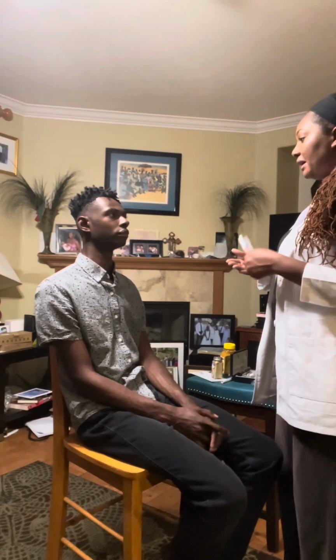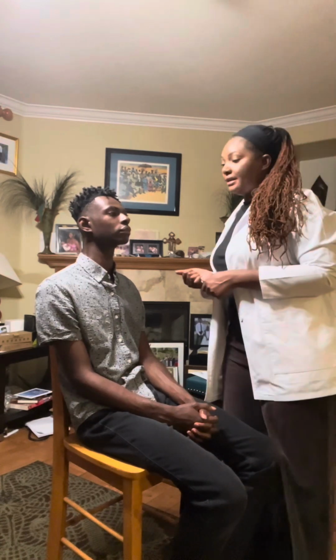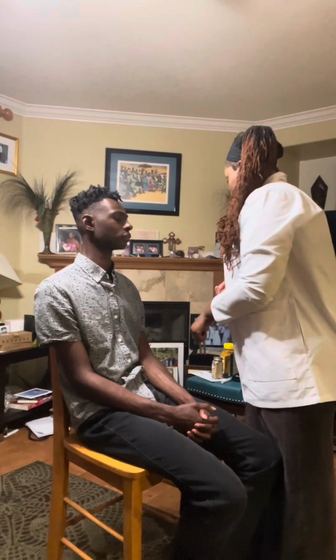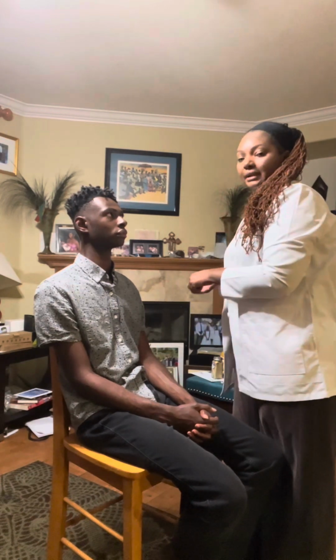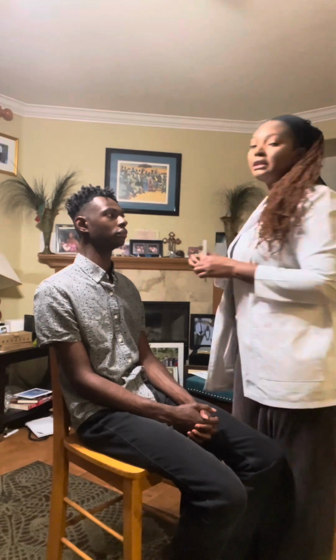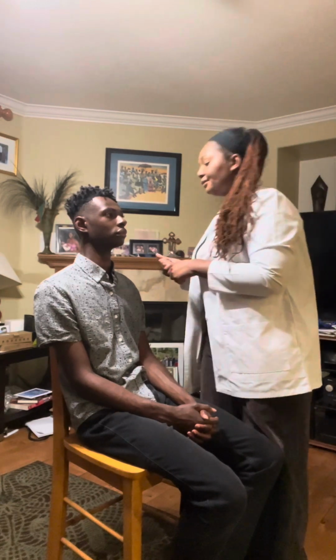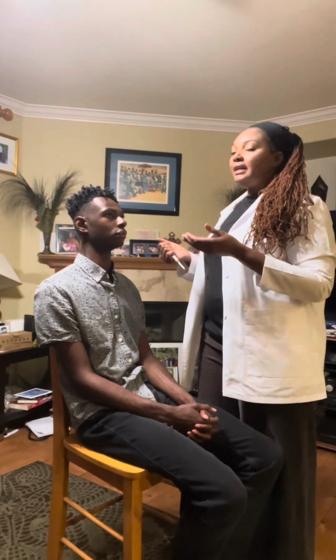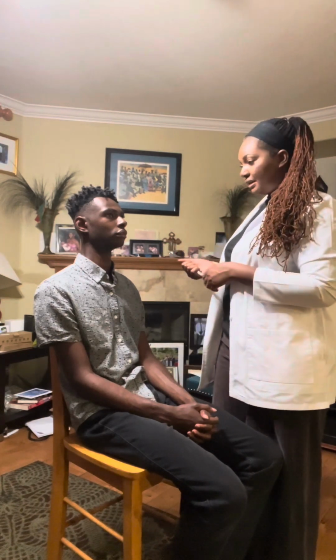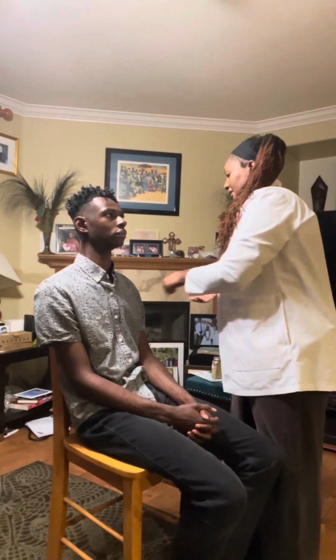Both Weber and the Rinne test. I'm going to do the Weber test now. I'm going to put this on the patient's forehead and ask the patient if they can hear in both ears.